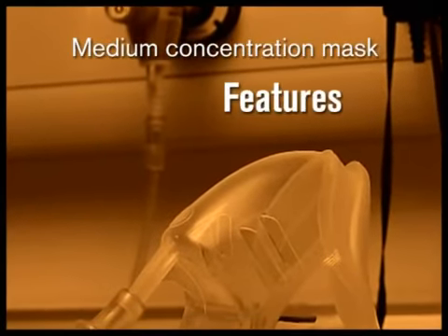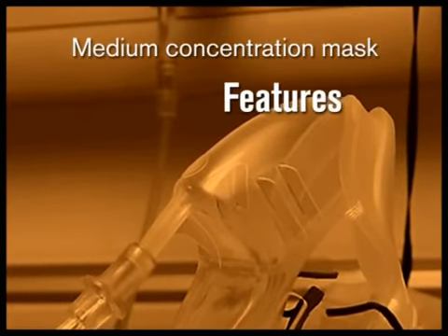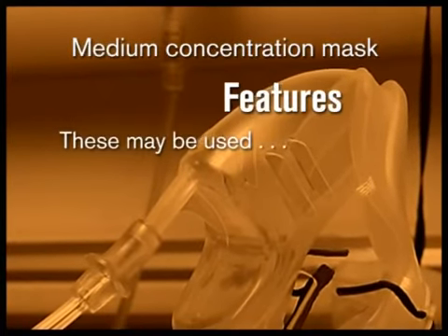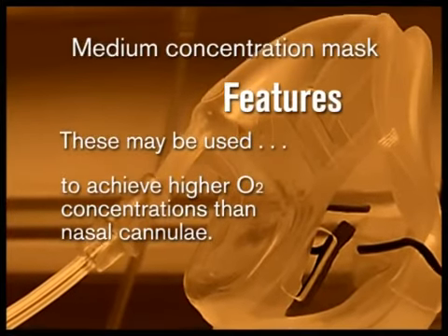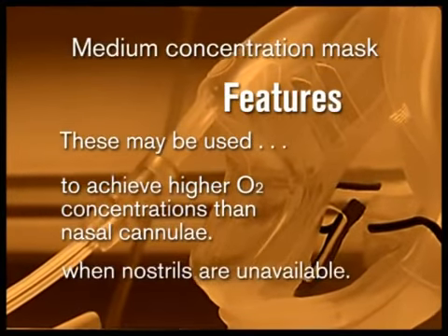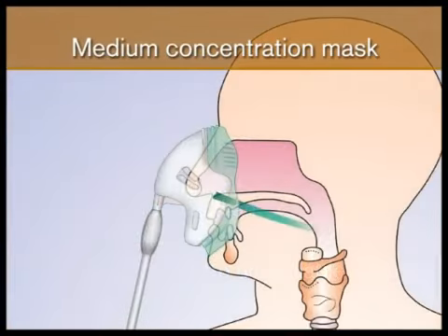Medium concentration face masks provide another option for the delivery of low-flow oxygen therapy. These may be used for concentrations higher than those that can be achieved with nasal cannula, or when the nostrils are unavailable. The concentration of oxygen received by the patient will vary.